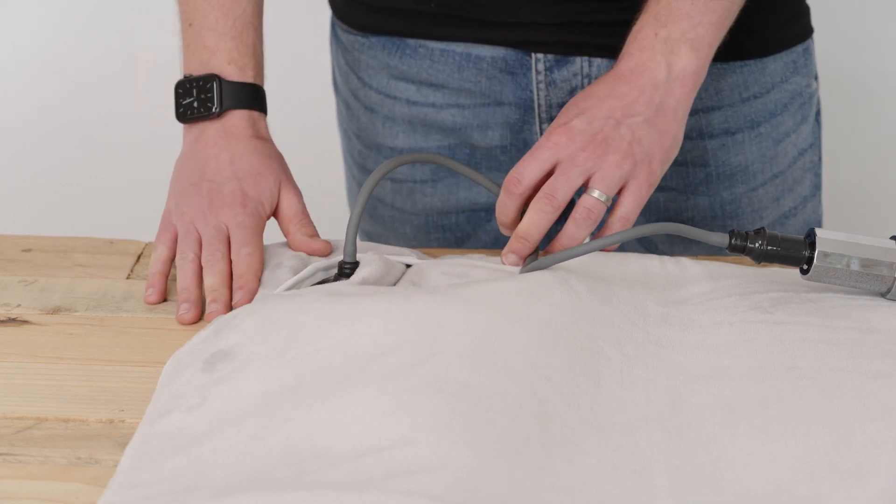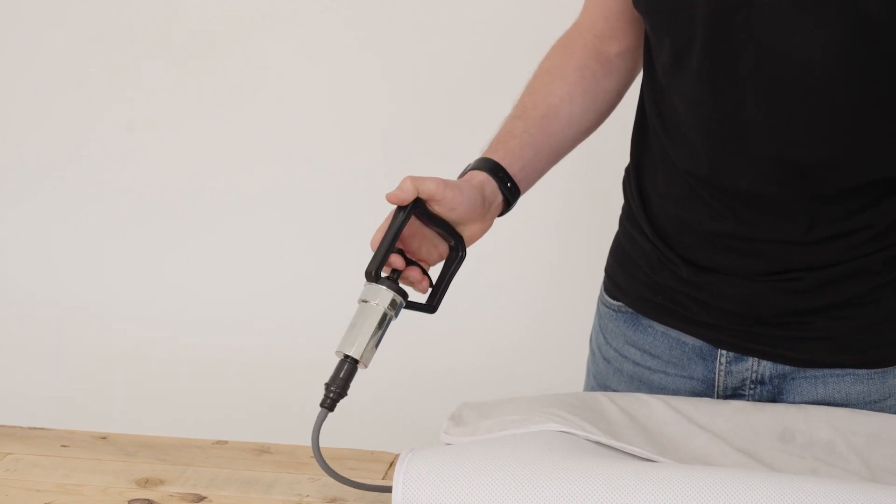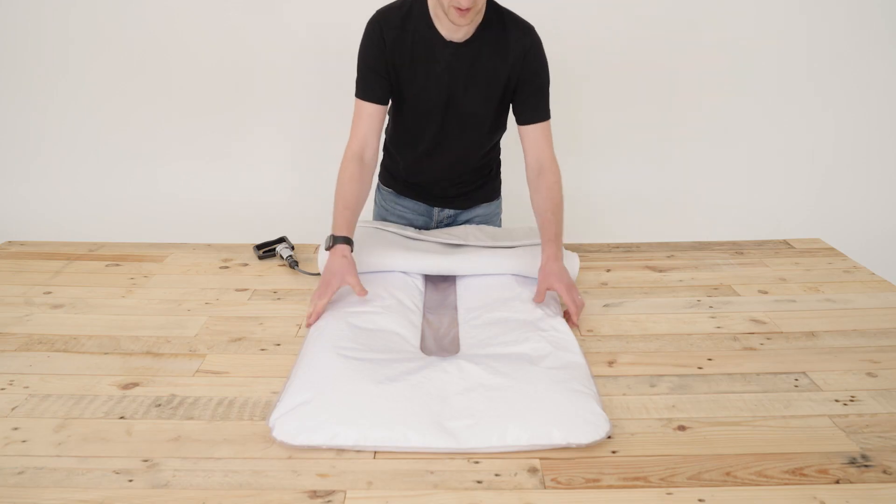Attach the pump to the valve. Fold the cover up to expose the base cushion. Use the pump to remove sufficient air from the base cushion so that it is moldable.